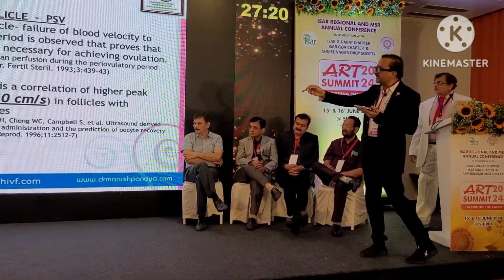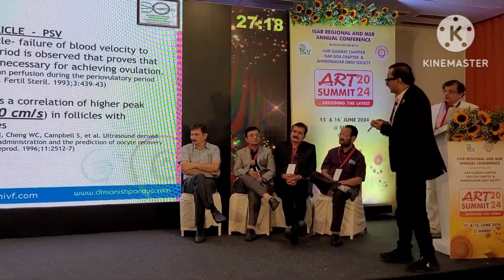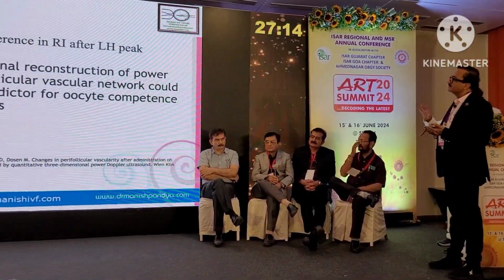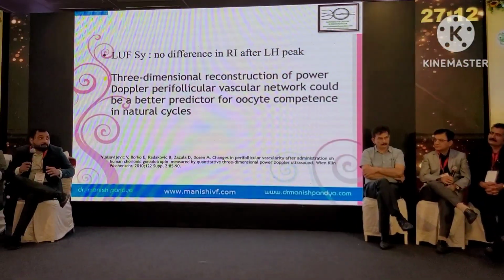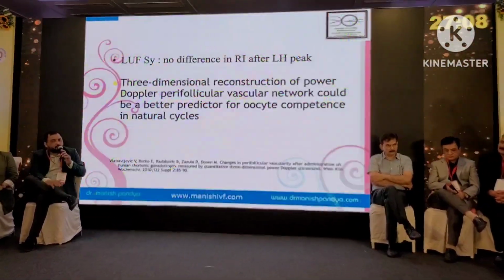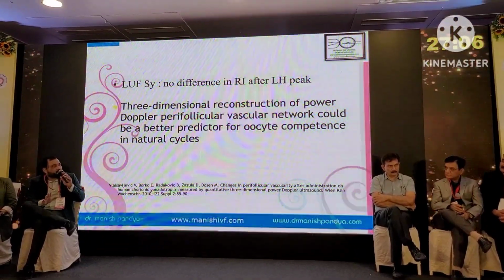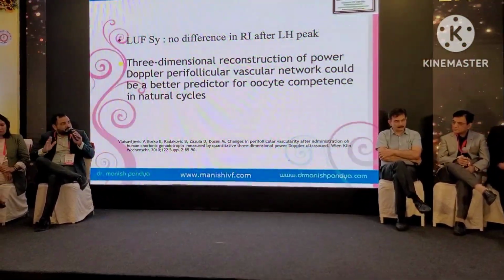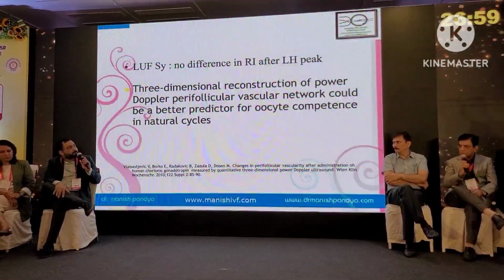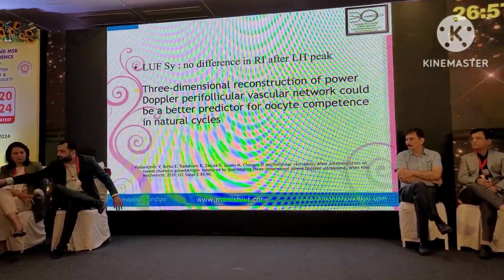You will hardly find any follicle which will not rupture if it goes beyond 25. If you have any resistance to that, please let us know. My question is whether we should do a double IUI or an early IUI in this case. No. That is good.